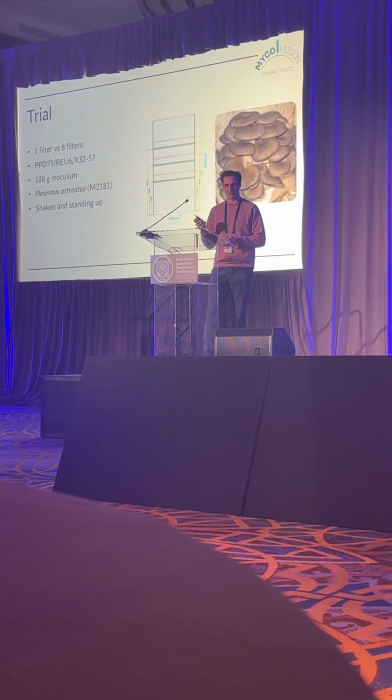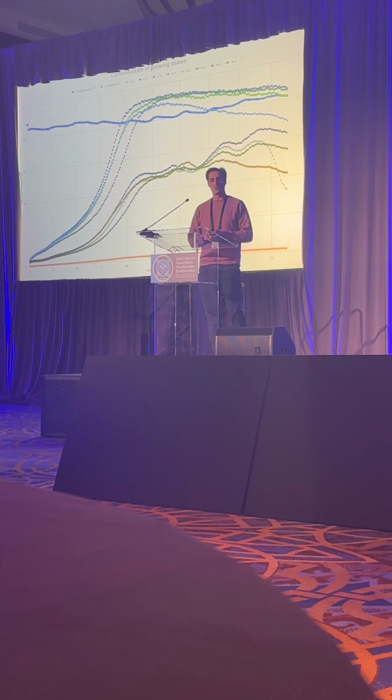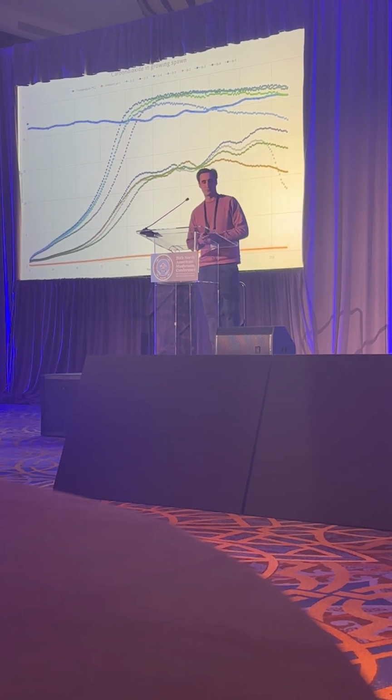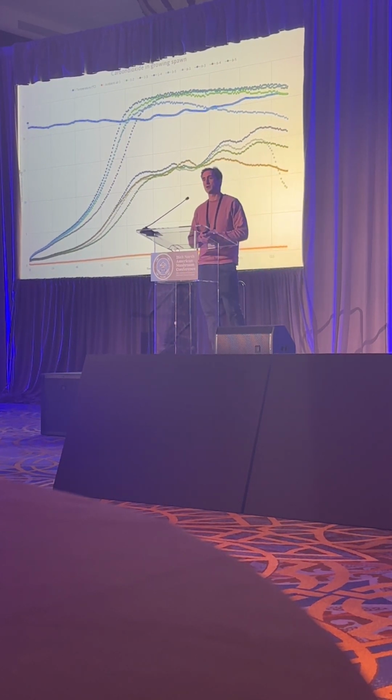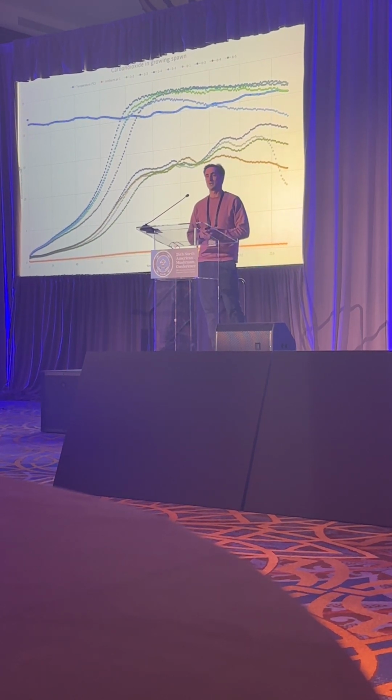And this is what the data looks like. Okay, so you can immediately see the difference between 6 filtered bags and 1 filtered bags. Let's focus on the 6 filtered bags first. As you can see, the first 24 hours, there is a slight increase in carbon dioxide. But it is relatively constant.